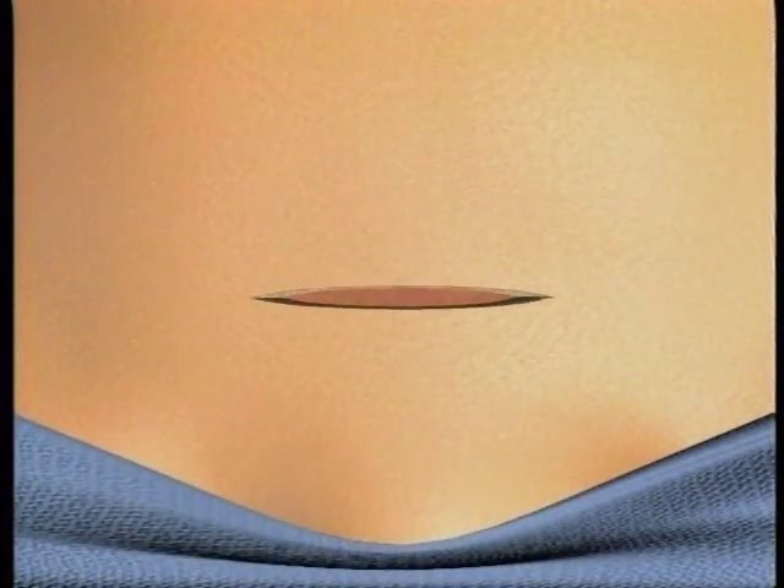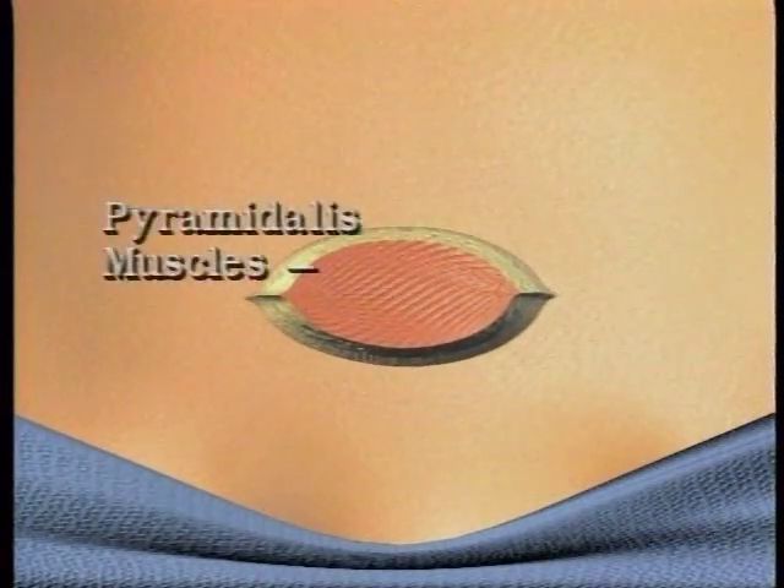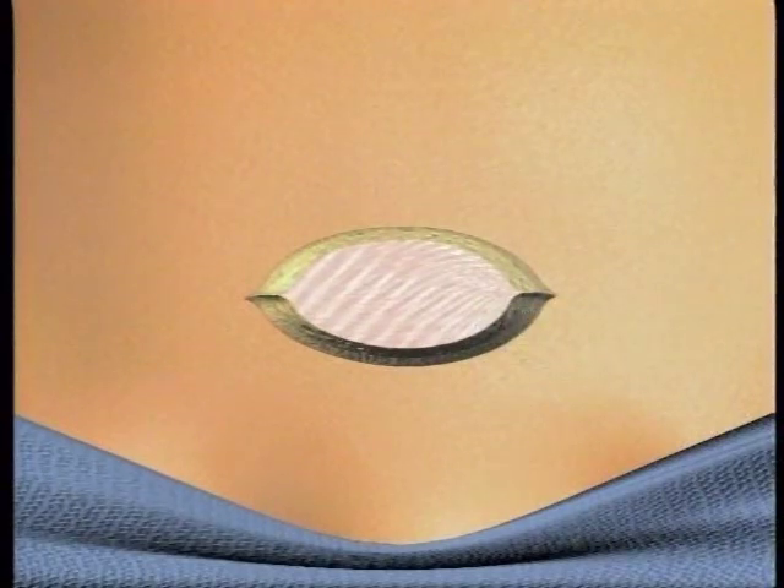For this surgery, we'll make an incision about three inches long, just above Deborah's pubic bone. Then we'll work our way through the pyramidalis muscles and the rectus muscles, carefully separating them to minimize trauma.